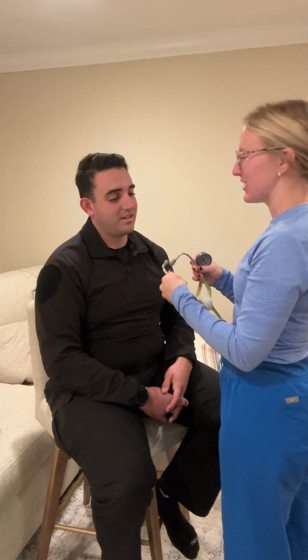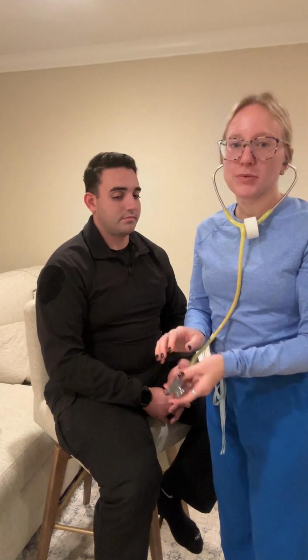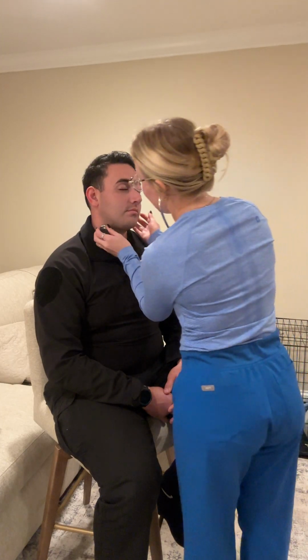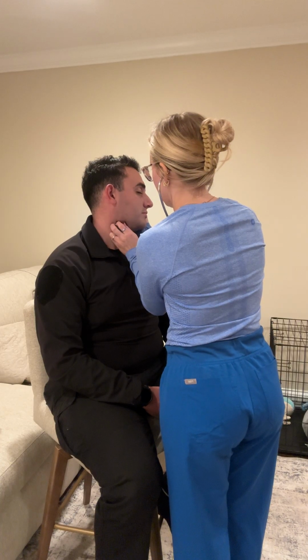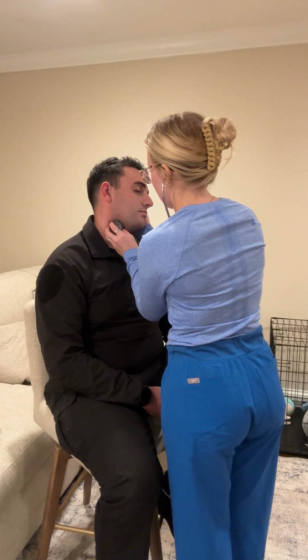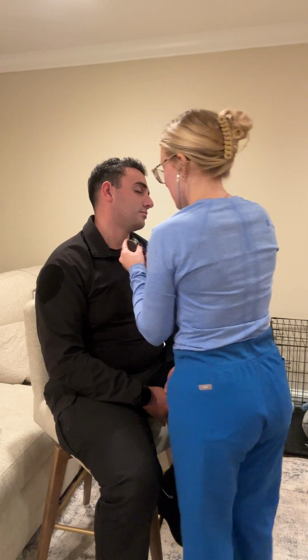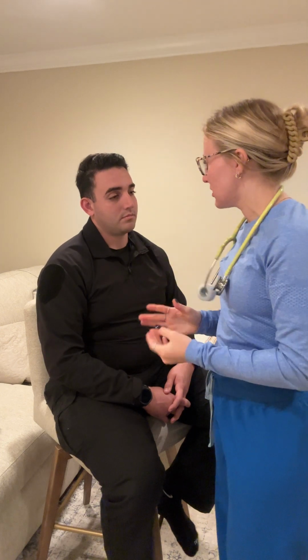And what we're going to do is we're going to auscultate to hear if we can detect any bruits or thrills. So I'm going to have you turn your head again. Perfect. Awesome. All right, so I have not noted any JVD in the patient, and I have not noticed any bruits or thrills upon carotid auscultation.